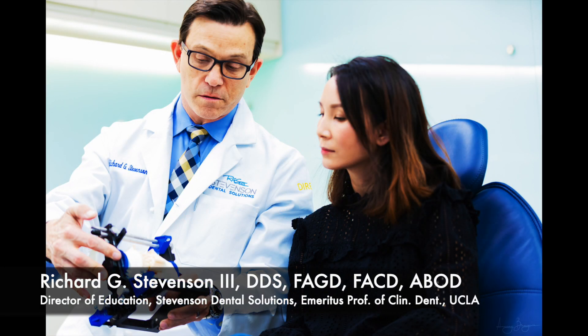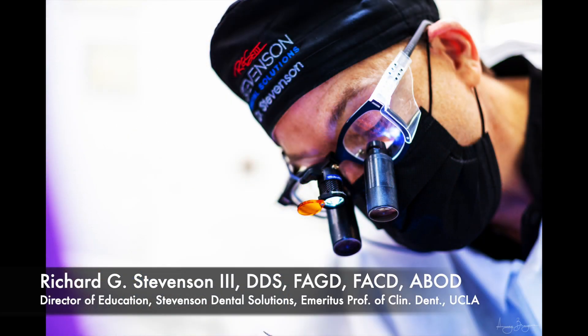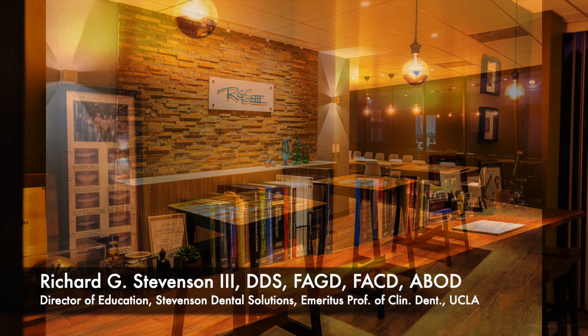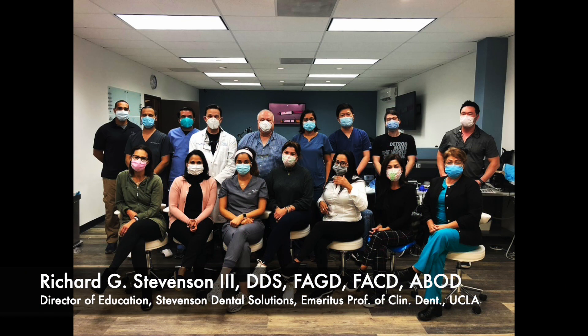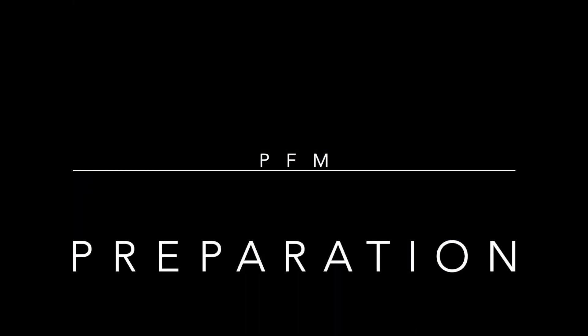Hey everybody, I'm Dr. Richard Stevenson and I'm the Director of Education at Stevenson Dental Solutions. I'm also Emeritus Professor of Clinical Dentistry at UCLA, and this is our teaching center where we conduct many hands-on courses all year long. Today we're going to cover the PFM on the maxillary first molar, tooth number three.